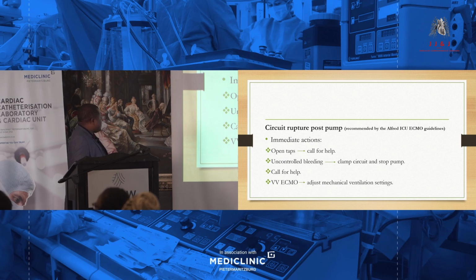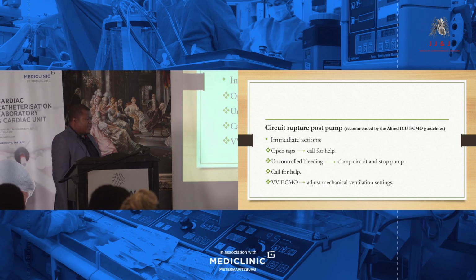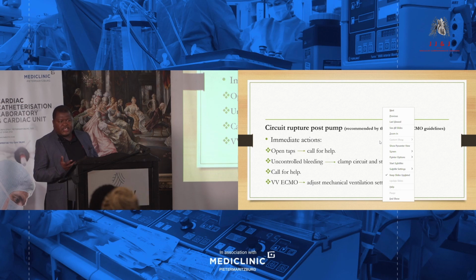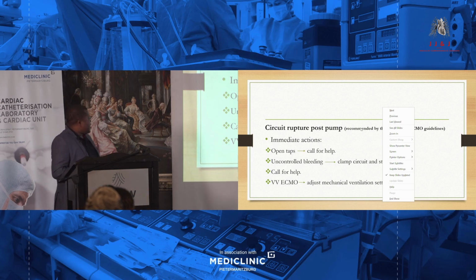And then if the patient is on VV ECMO, it's the same as before. You're going to adjust the mechanical ventilation settings where you want to have adequate oxygenation and ventilation. Next slide.